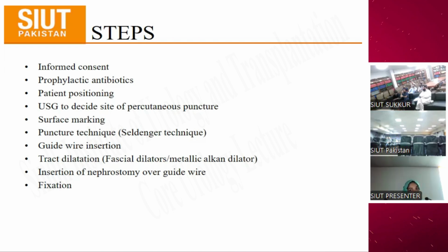Sir, we place it in the renal angle, which is in the prone position. It is situated just below the last rib, the subcostal margin, medially, and lateral to the erector spinae muscle, the lateral border of the erector spinae muscle. Right. So that is the renal angle, and I'm pretty sure that everybody knows it.